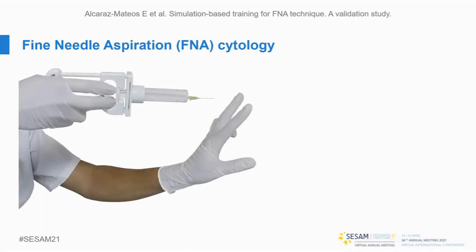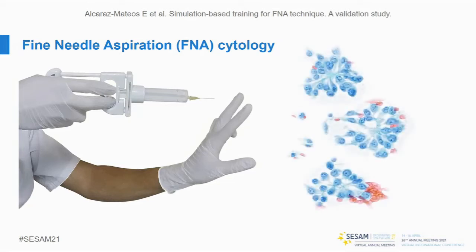So fine needle aspiration procedure is a common technique in the daily practice at the hospital and is performed by pathologists, radiologists, and others like ENT physicians, endocrinologists, among others, based on tradition and organization of the institution. This procedure helps to diagnose lesions with morphological alterations, that is, infectious, inflammatory, or neoplastic diseases, without anesthesia and with a minimum of asepsis and antisepsis measures.